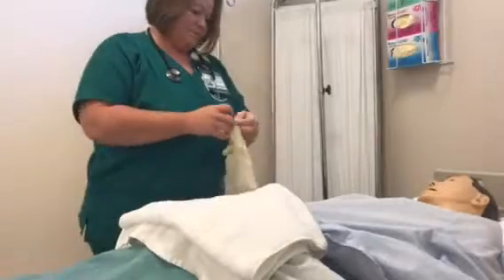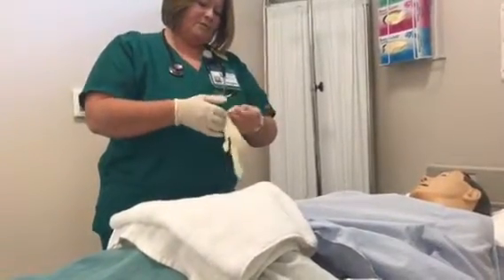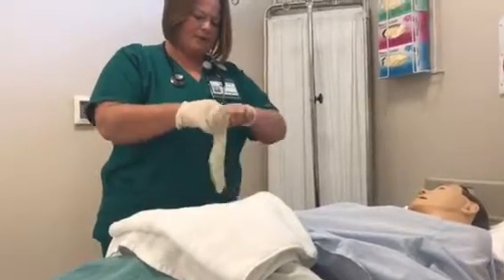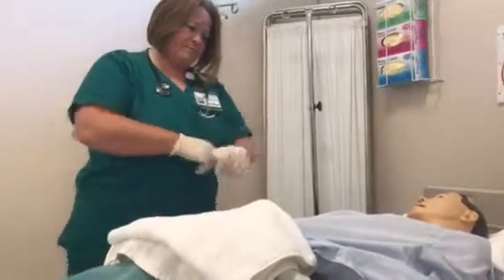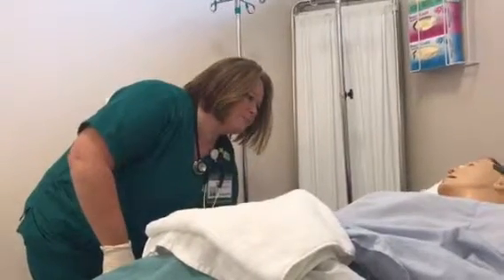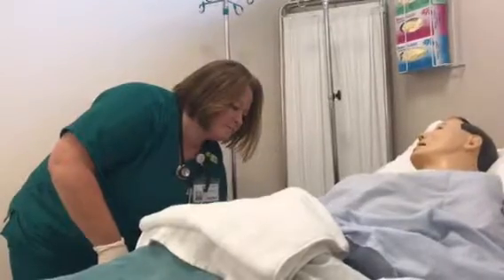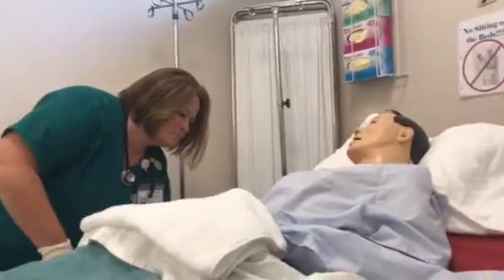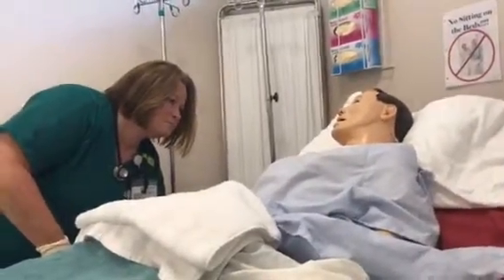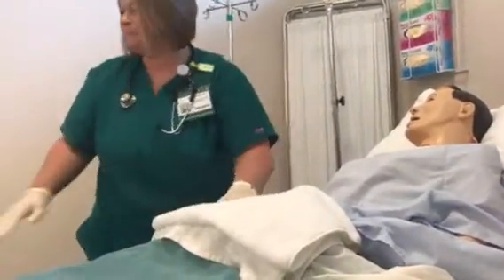Are you doing okay? When I get my gloves on here, I'm just going to raise the head of your bed. Can you tell me your full name and date of birth? Good. I need to sit you up at about 30 degrees. Okay. Perfect. Are you comfortable? Okay.